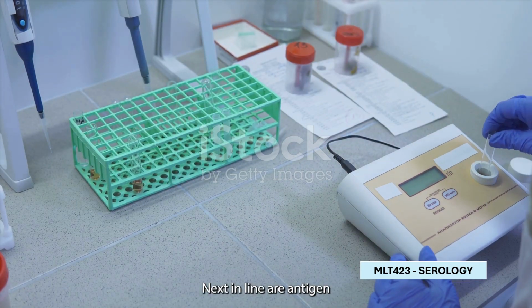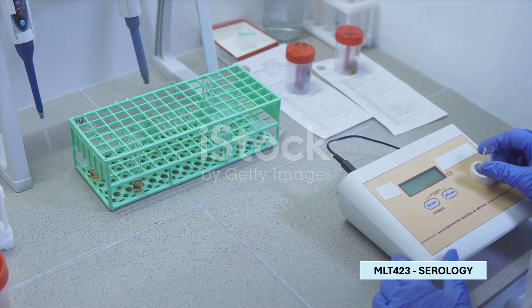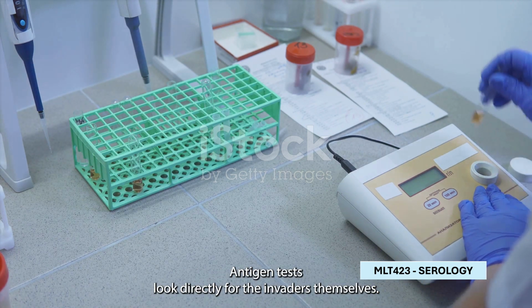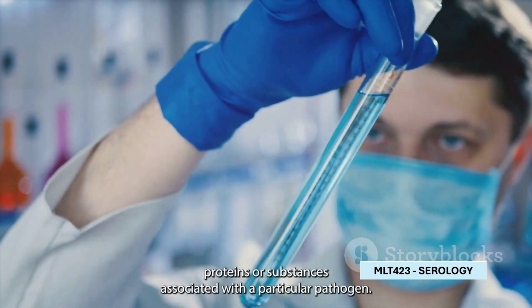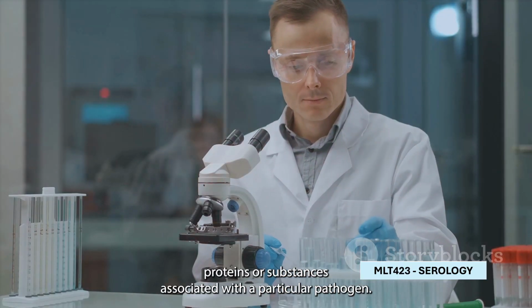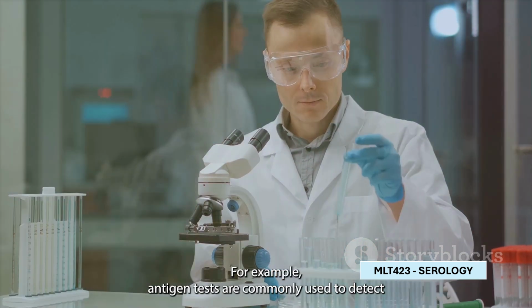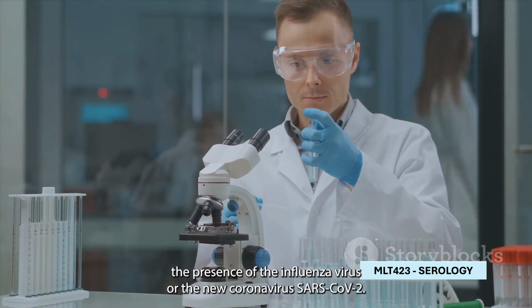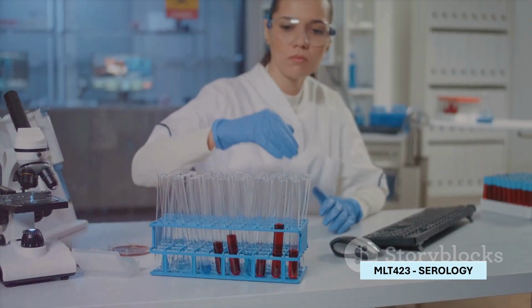Next in line are antigen tests. While antibody tests hunt for the body's response to an invader, antigen tests look directly for the invaders themselves. These tests identify specific proteins or substances associated with a particular pathogen. For example, antigen tests are commonly used to detect the presence of the influenza virus or the new coronavirus, SARS-CoV-2.